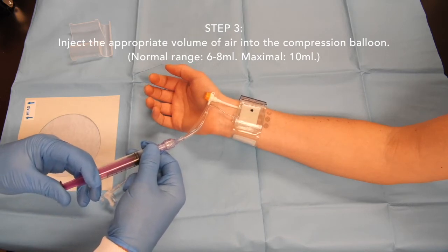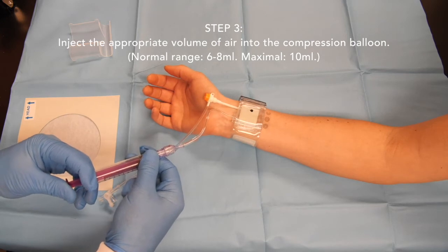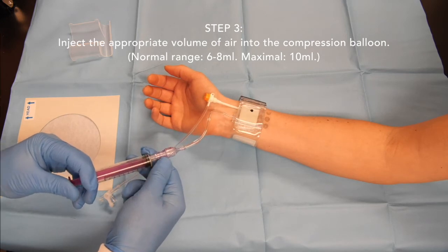Gradually depress the syringe barrel to transfer the air from the syringe through the valve air line to the compression balloon. The normal transfer volume range is 6-8 ml. The initial volume transfer should be no more than 10 ml.